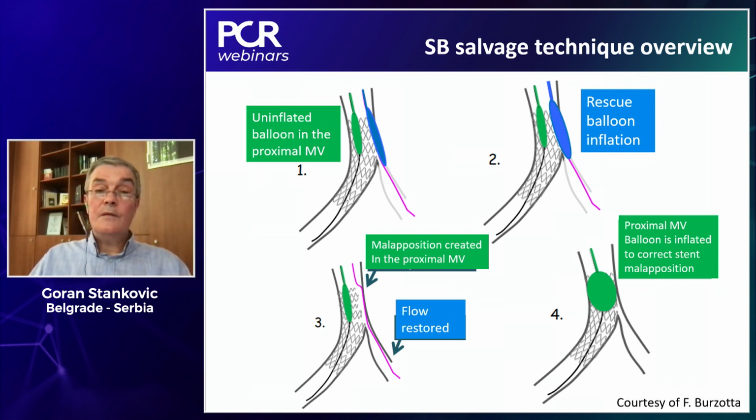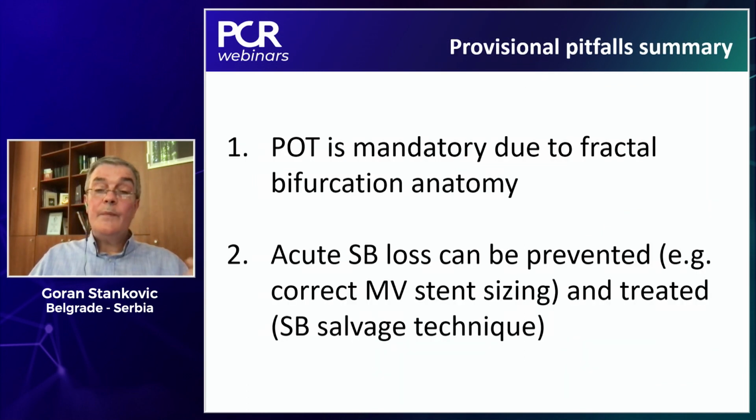So we feel really relaxed that this works, and this works also in the left main, and keeping this option in mind really helps us put in perspective the EBC main data suggesting provisional. Jens, how can you put this in perspective that now we have good 1-year clinical outcome results from EBC main, but we need to be aware of potential pitfalls, and we know that we have a solution also.